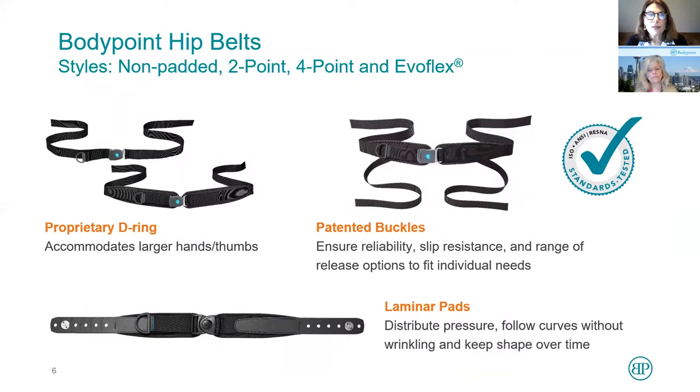That's a key difference with a postural support. BodyPoint makes all kinds of belts: non-padded belts, two-point padded belts, four-point padded belts, and my personal favorite, the EvaFlex. We're going to look at how to attach any of these belts.